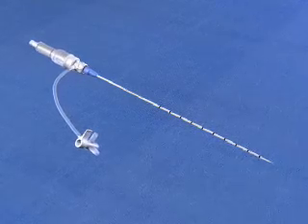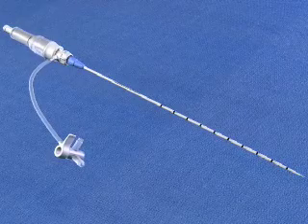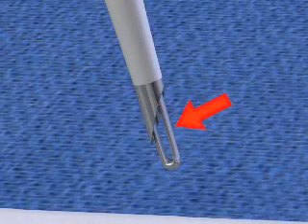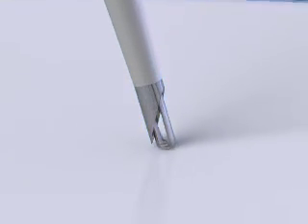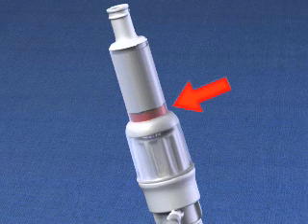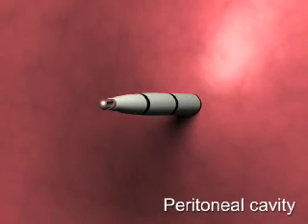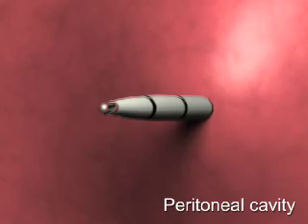In this video, we will demonstrate the use of a paracentesis-specific needle and catheter assembly. This device has a safety mechanism with a retractable blunt obturator. When pressure is applied to the distal end of the device, the obturator retracts and the bevel of the needle is exposed, allowing penetration of the tissues. An indicator at the top of the device will turn red whenever the obturator is retracted. Once the peritoneal cavity is entered, the obturator redeploys. This safety mechanism theoretically reduces the risk of organ injury.